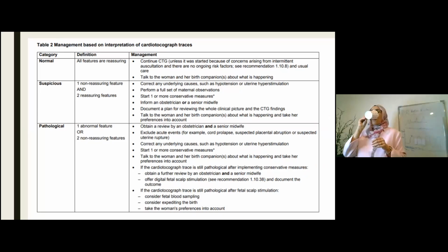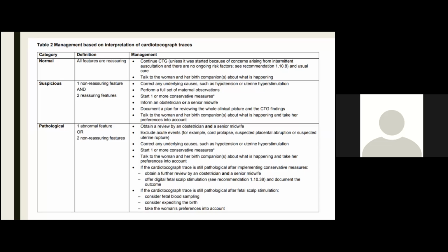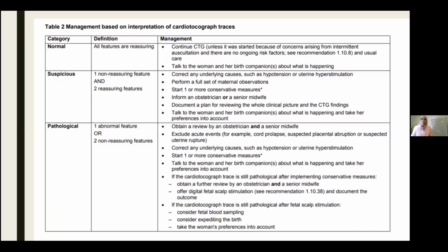There's another question here saying, can you please show how you measure the fetal markers if it is pathological? Can you rephrase it? We are talking about the numbers, right? No, sorry, I meant just, on the head, to measure the acidity, when you mentioned on the baby's head, just how is that done? Oh, okay.